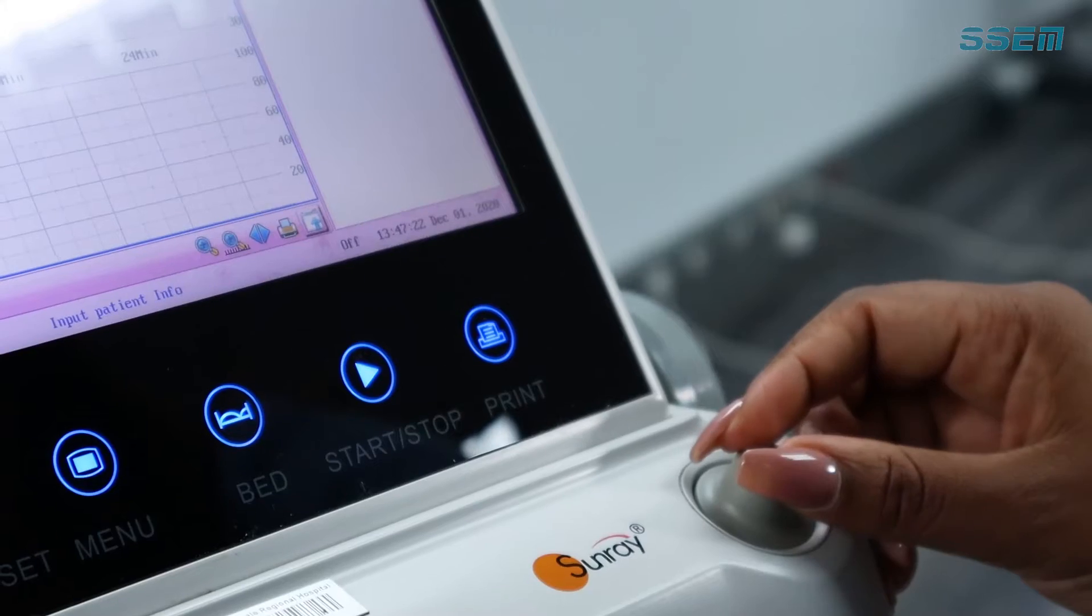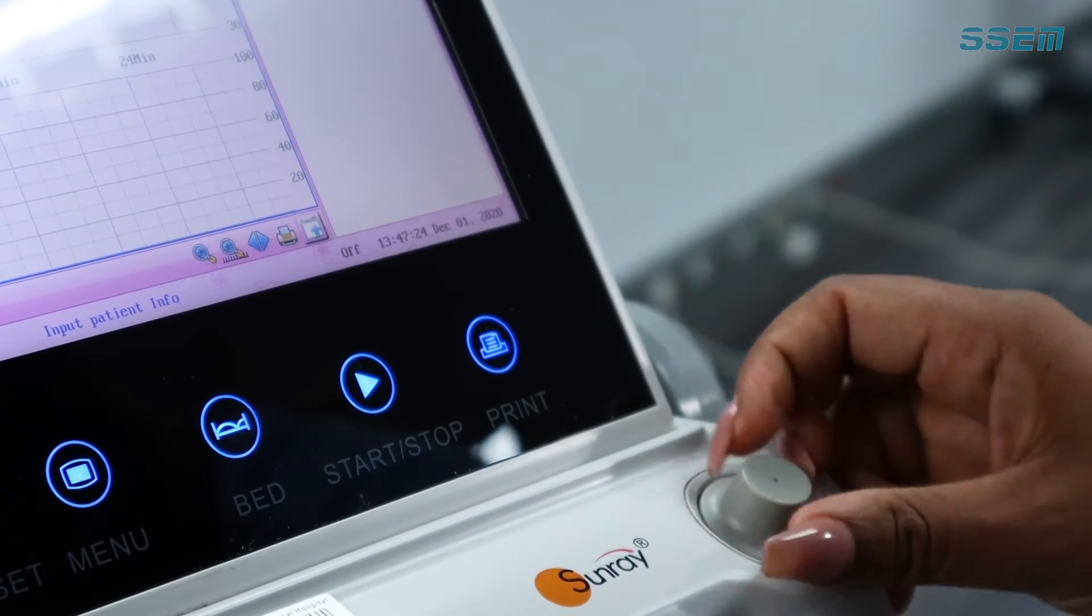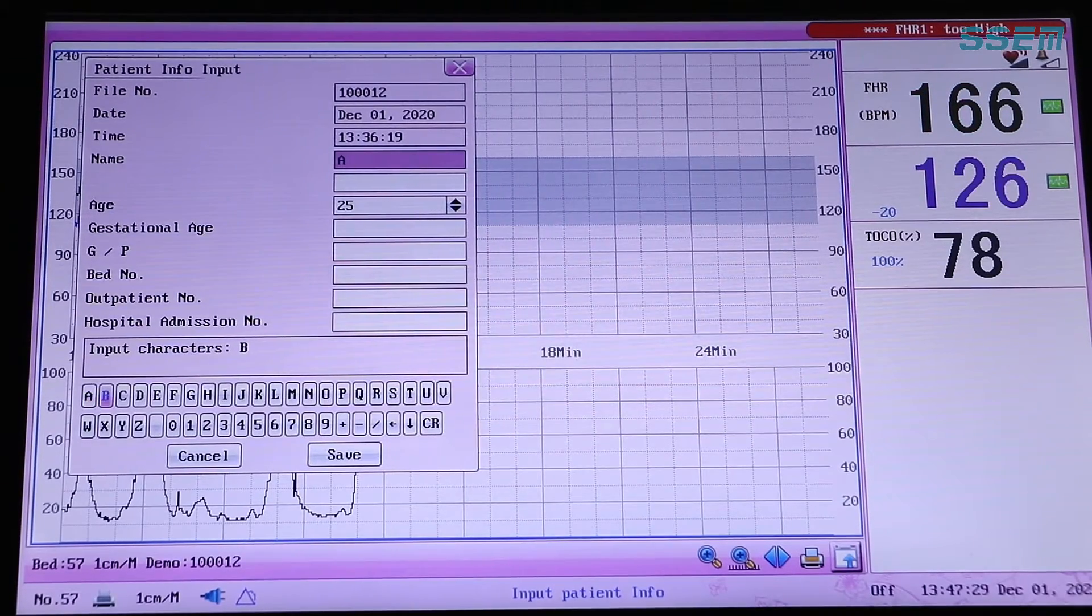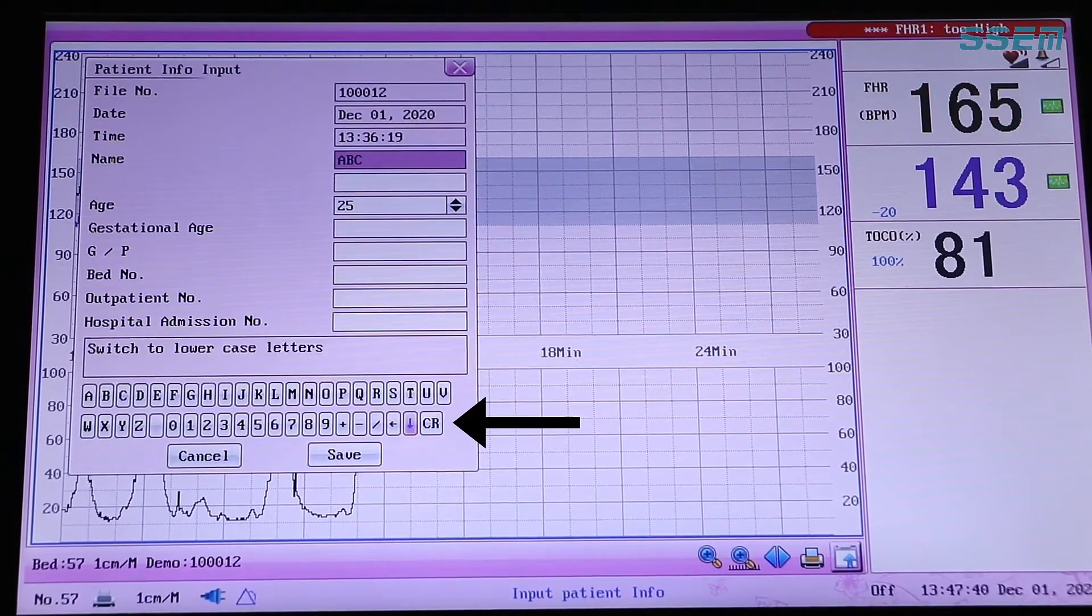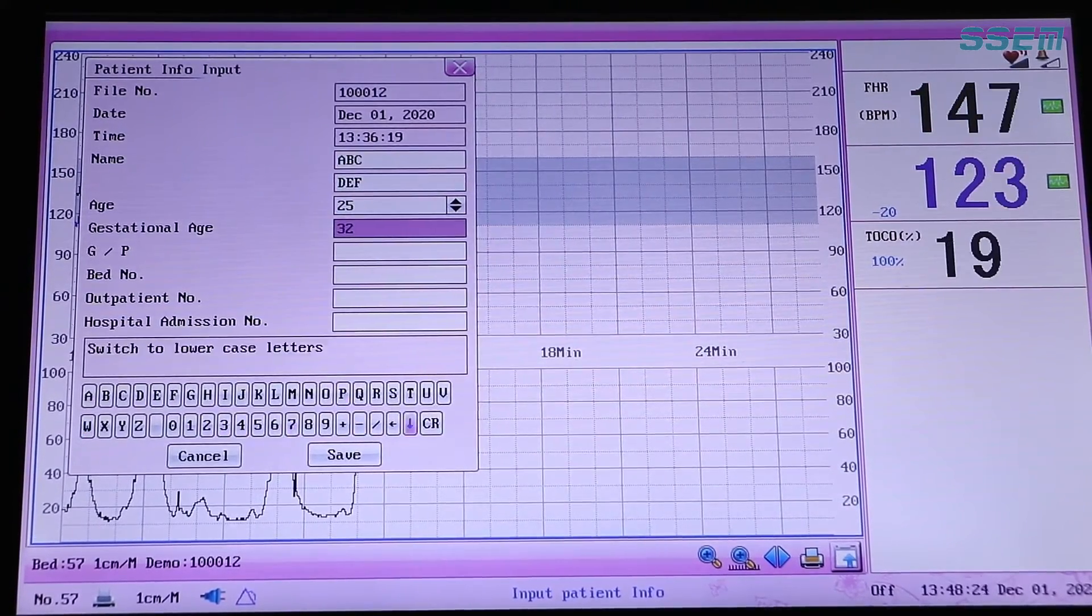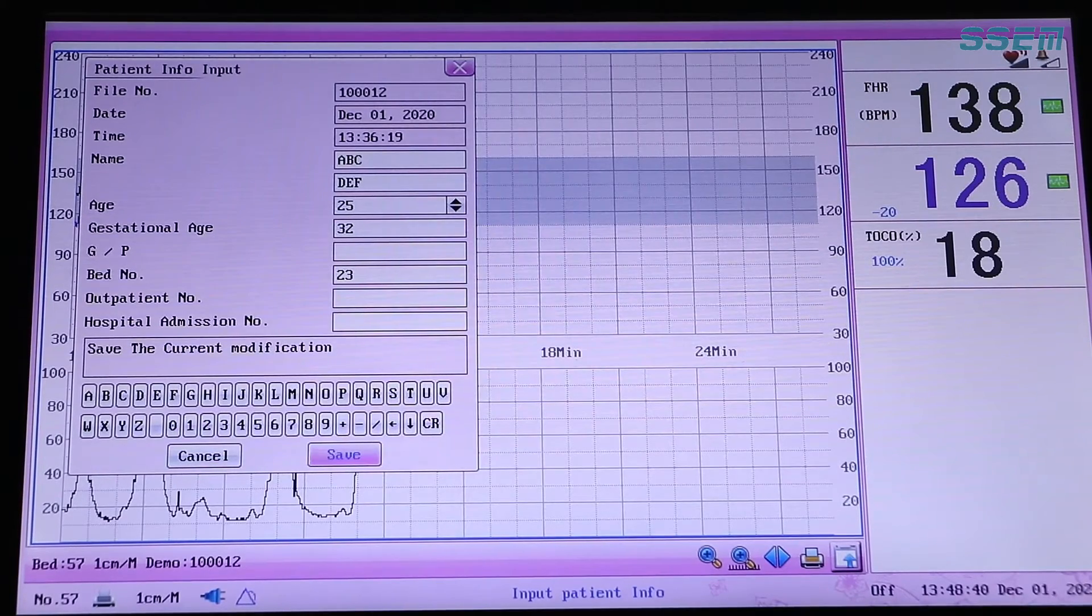Using the control knob rotate it to the name field and select. Automatically the keypad will be selected to type the patient name. Select CR to move to the next field. Continue this till you have completed the file and select save.